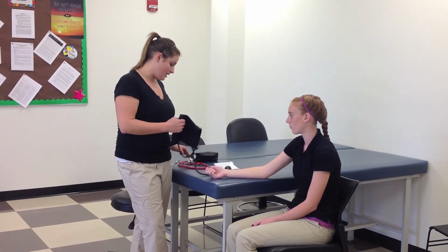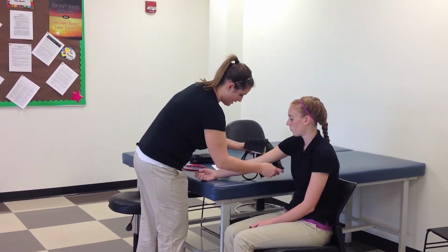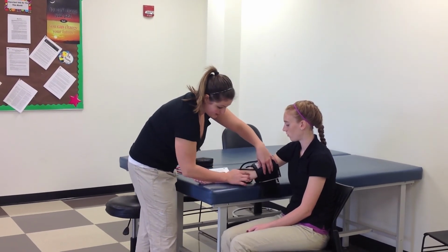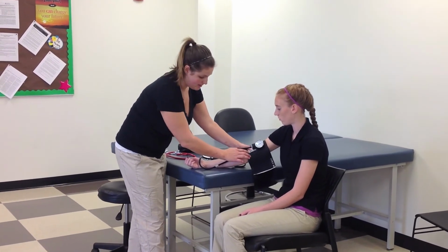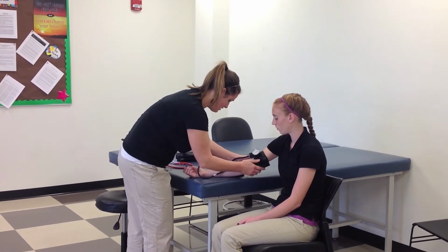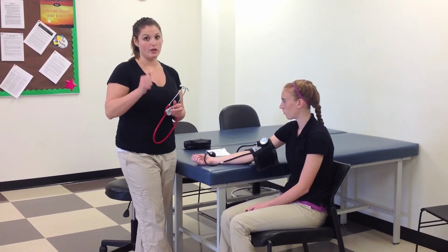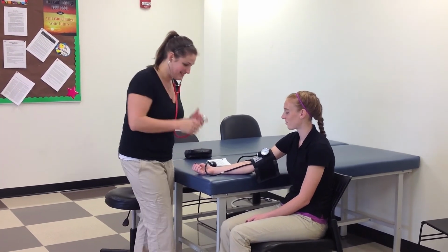And next, you want to apply the cuff and put the bladder of the cuff over the medial aspect of the arm. So right here, you can tell on this cuff it's nice because it says right arm, and there's an arrow to where you should have it. When you start to pump up the cuff, you want to pump it up till you cannot hear the pulse in the arm anymore. So I'm going to show you how to do this.